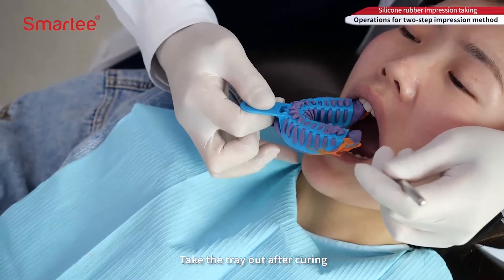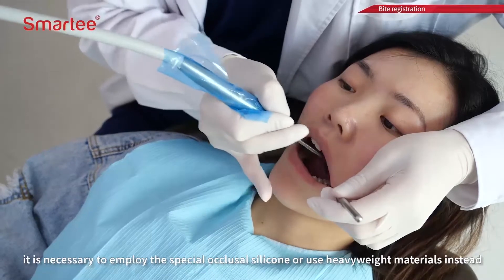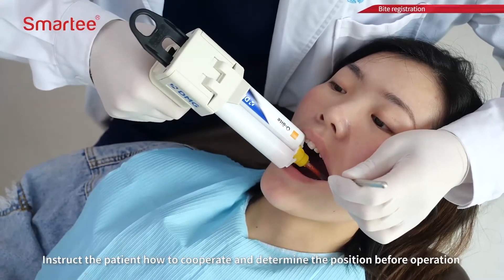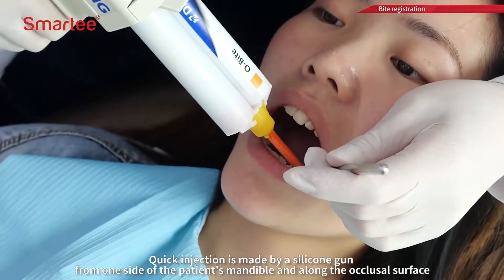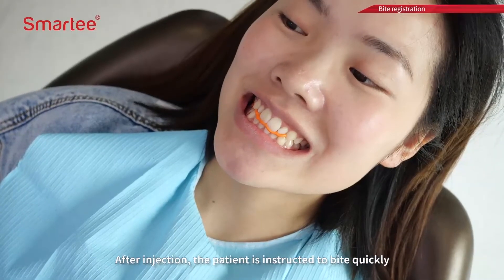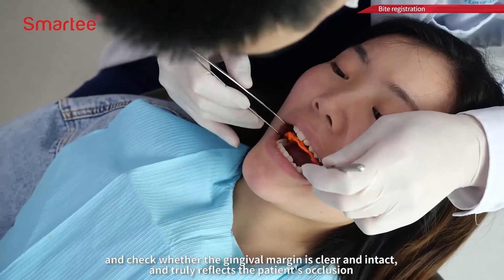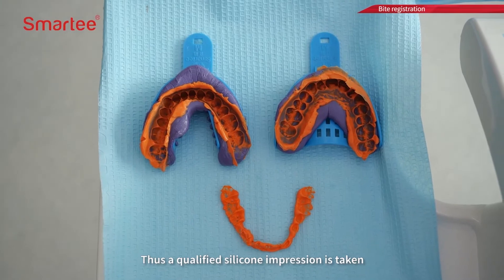Take the tray out after curing. To obtain bite registration records, it is necessary to employ special occlusal silicone or use heavyweight materials instead. The bite registration records reflect the patient's occlusal condition. Quick injection is made by a silicone gun from one side of the patient's mandible and along the occlusal surface. After injection, the patient is instructed to bite quickly. Take out after curing and check whether the gingival margin is clear and intact and truly reflects the patient's occlusion. Thus, a qualified silicone impression is taken.